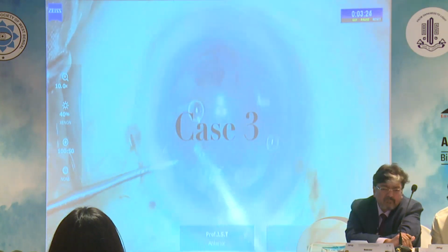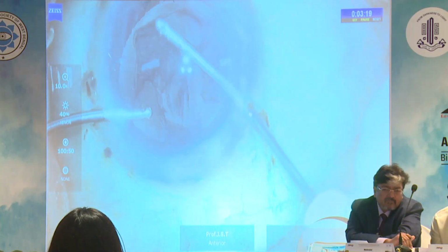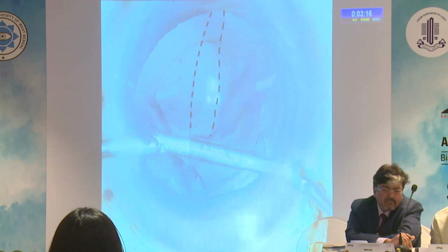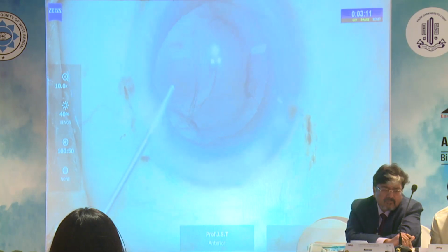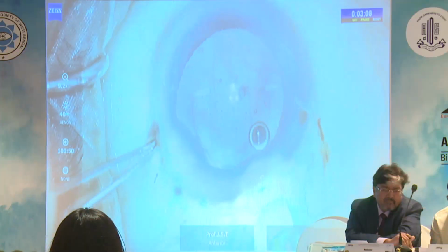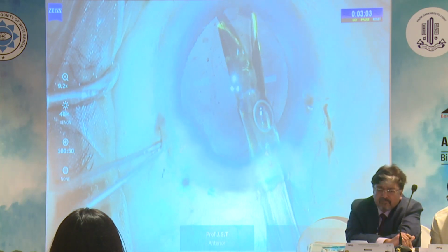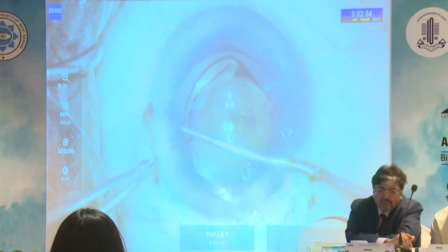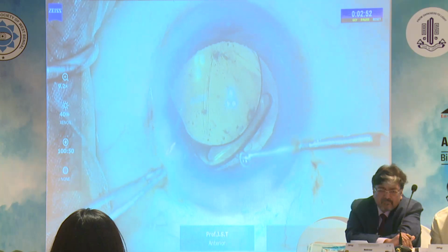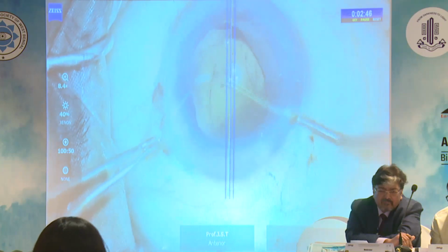In this case, planned for a phacoemulsification with toric monofocal IOL implantation, a large central posterior capsular rupture was observed at the end of cortical aspiration. A dispersive OVD was injected over the PC defect to avoid injecting directly through the capsulorhexis with an open posterior capsule. The intraocular lens was first placed in the sulcus. Both haptics were then tucked beneath the anterior rhexis while aligning the toric IOL along the required axis. A reverse optic capture was performed to stabilize the intraocular lens.